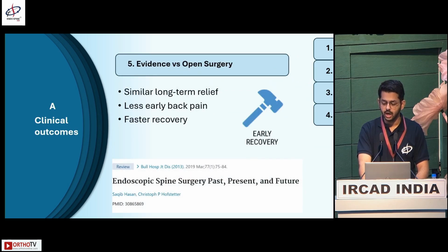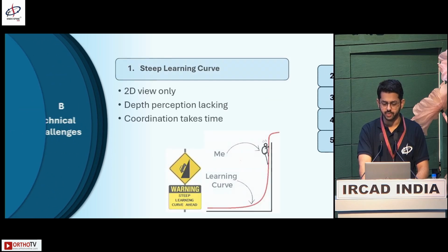When well done, endoscopy offers similar or better long-term outcomes than open discectomy. Patients often experience less post-operative back pain and return to function earlier.